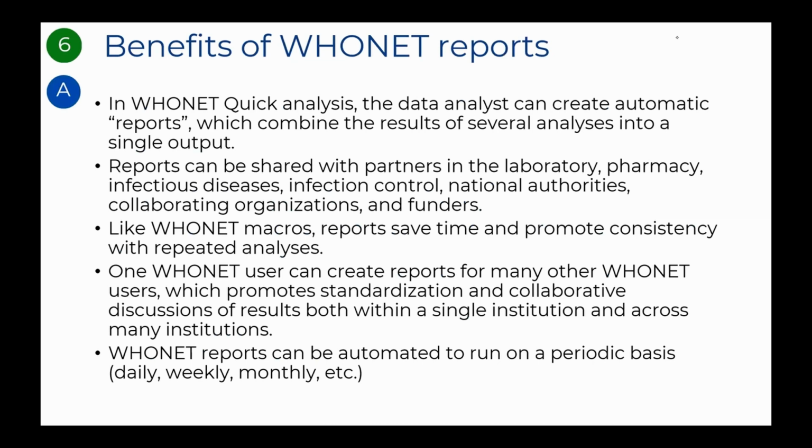Benefits of WHONET Quick Analysis Reports. WHONET can create automatic reports which combine the results of several analyses into a single output. Reports can be shared with partners in the laboratory, pharmacy, infectious disease, infection control, national authorities, collaborating organizations, and funders. WHONET macros and reports save time and promote consistency with repeated analyses.